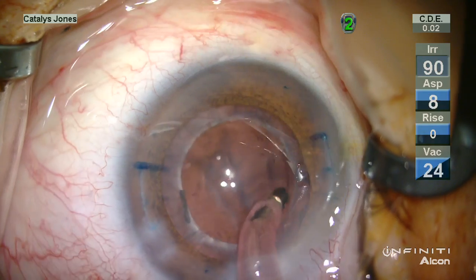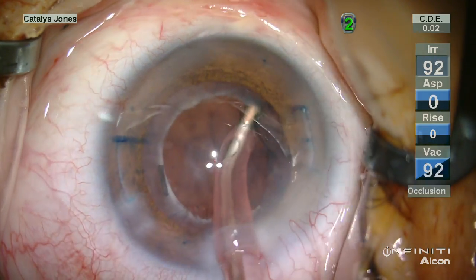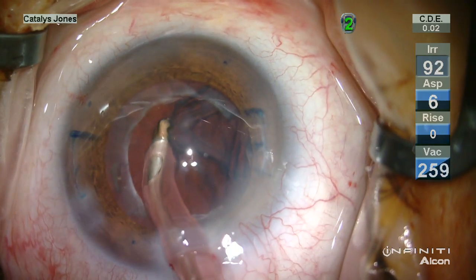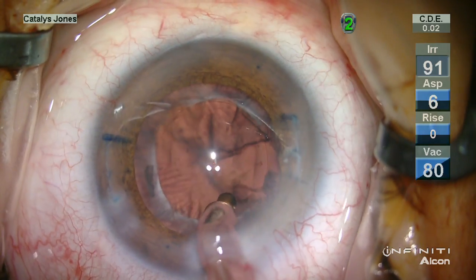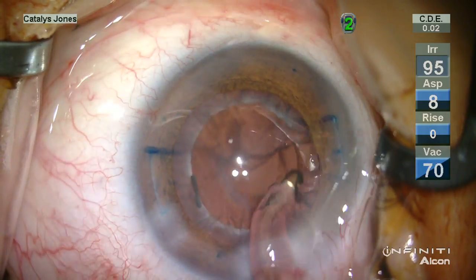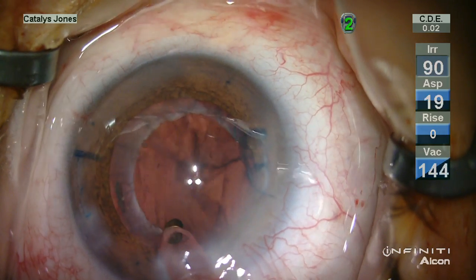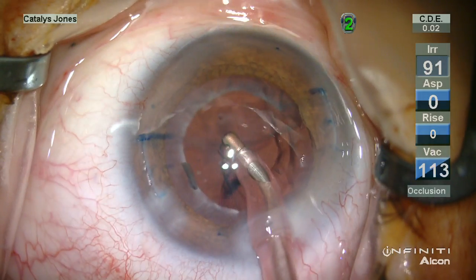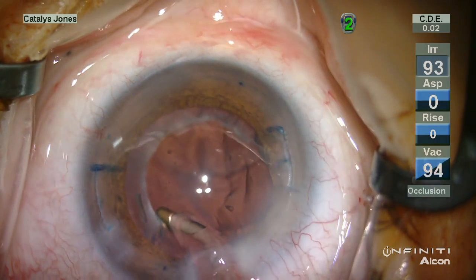Cortical removal is very similar to a routine case. There is a lack of handles, if you will, around the capsule rim in this laser system. However, there still seems to be relatively easy ability to purchase the material and remove it both circumferentially and radially.